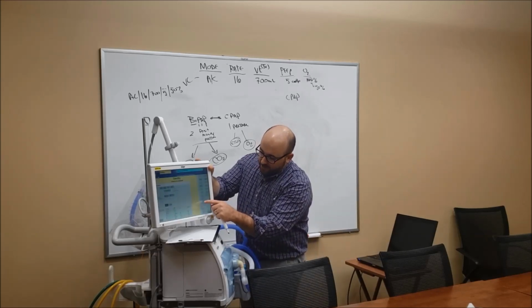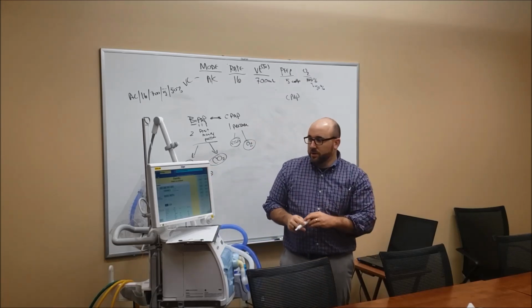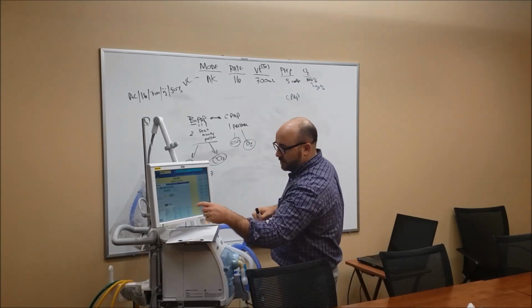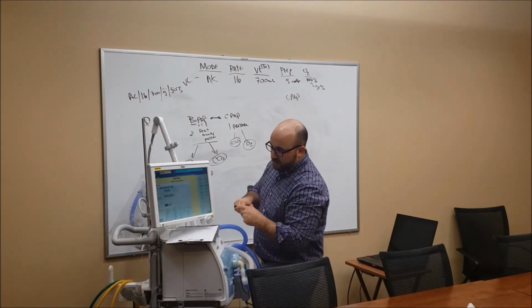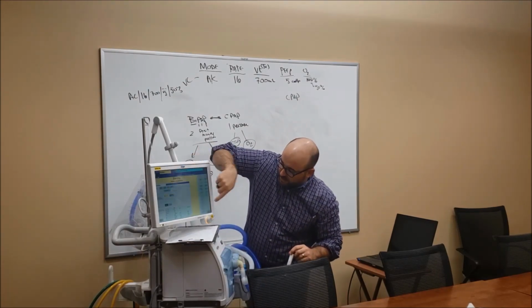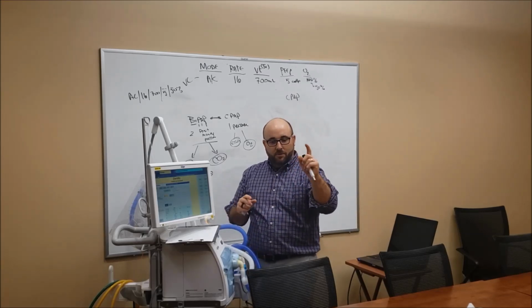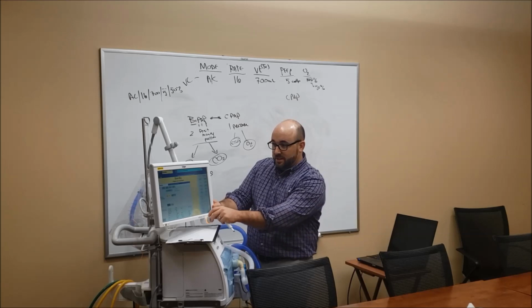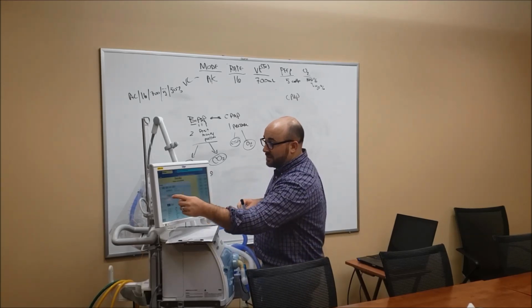It's a soft key, and it says O2 suction. It's in the same place on every one of these. So with this machine, every time you touch something, you see it turns yellow, this thing lights up. So you see it goes away. When I touch something, it's like, are you sure you want to do it? To confirm it, you push the button in each time. Touch, adjust, confirm is what it is. Touch, adjust, confirm. So with that oxygen button, it's the same way.